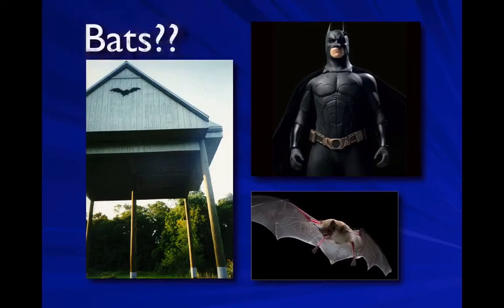So ultrasound, we need to talk about bats, and that is the bat house here at UF. We talk about bats because there were early experiments in the 1800s done by a gentleman called Spallanzani, an Italian guy who blindfolded bats, and he figured that they could navigate if blindfolded, but they bumped against each other or against obstacles if their ears were covered. Again, I don't know how he blindfolded bats, but he managed to do that. And in the 1940s, what was called Spallanzani's bat problem was figured out at Harvard, and they figured that bats emit sound waves around 100,000 hertz.